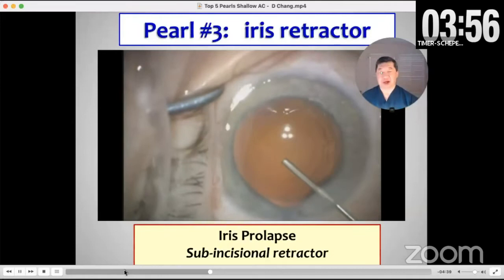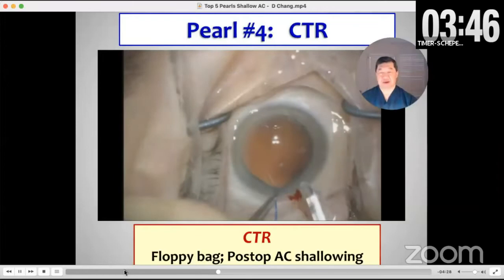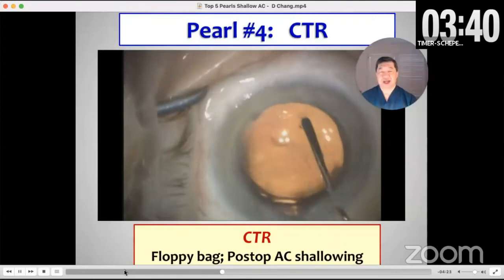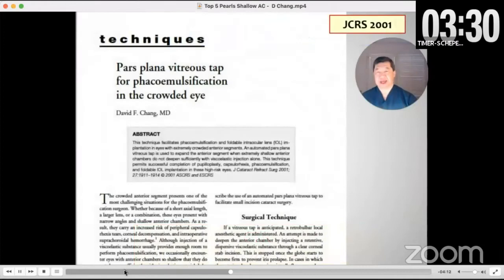It's key to do this the minute this happens. Of course, you could try intracameral phenylephrine. The next pearl is to use a CTR for the reasons I mentioned with the floppy bag. Here's the 28.5 diopter IOL — this puts the bag on a stretch. In cases where I've had shallowing of the anterior chamber, using the CTR on the fellow eye seems to help mitigate that.